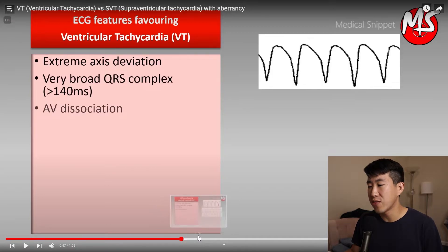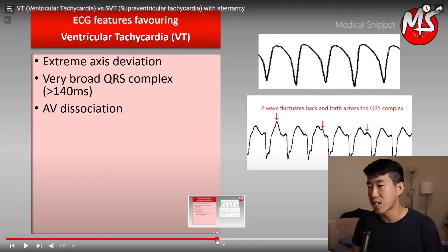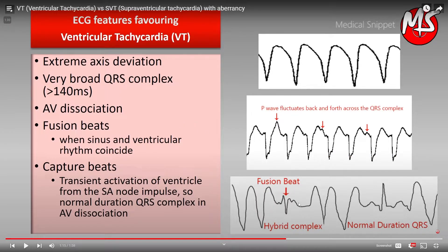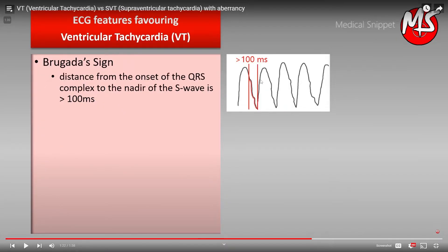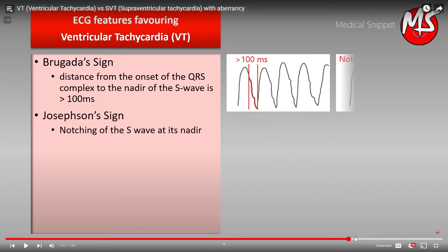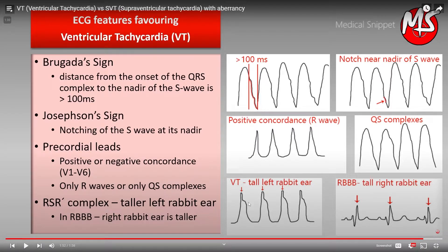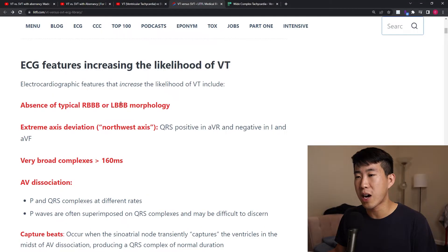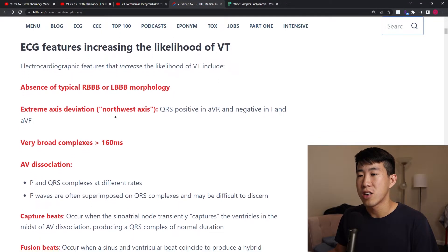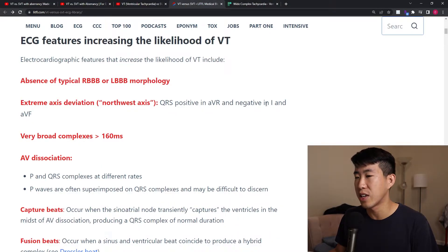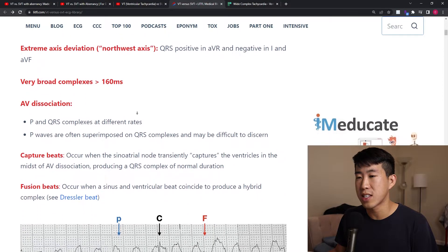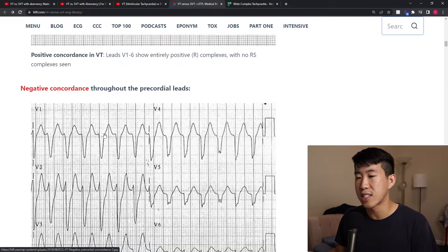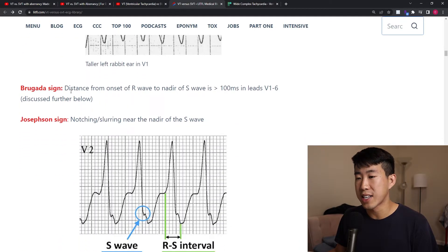To summarize the key criteria for VT: very broad QRS complexes, AV dissociation where the P wave fluctuates across the QRS complex, fusion beats, capture beats, Brugada sign (RS interval > 100 ms), Josephson sign (notch near S wave nadir), positive or negative concordance, RSR prime with taller left rabbit ear, and extreme northwest axis deviation with positive QRS in aVR and negative in leads I and aVF.